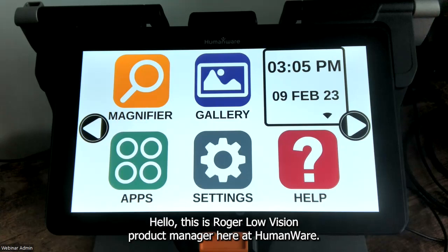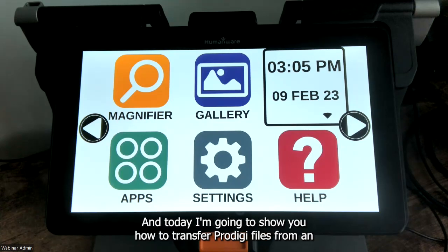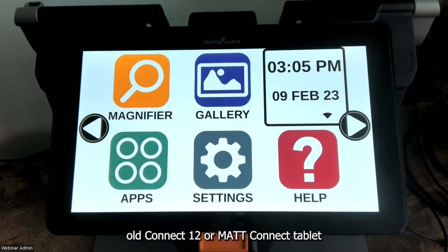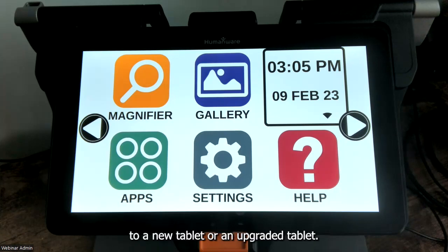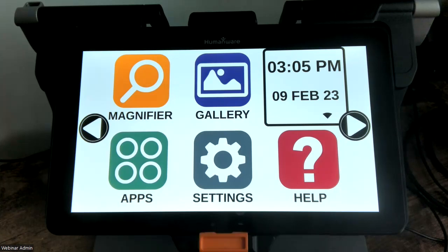Hello, this is Roger, Low Vision Product Manager here at HumanWare, and today I'm going to show you how to transfer Prodigy files from an old Connect 12 or MatConnect tablet to a new tablet or an upgraded tablet.